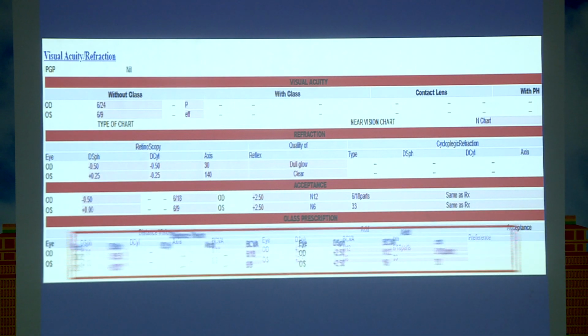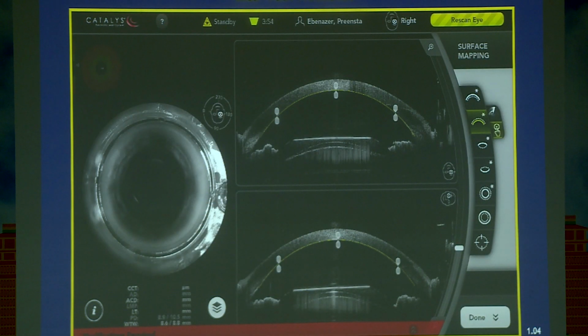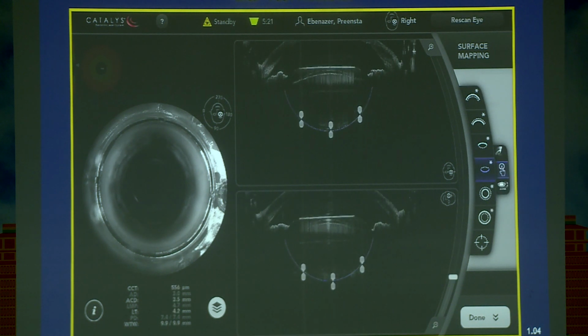And you can see the result that you achieved in this case compared to the phakic intraocular lens. Obviously, the intraocular lens takes care of the refractive error even better. But this is not the way to do it primarily because of the retinal complications that can be associated with it. It's also possible to use a laser platform even in the presence of a phakic intraocular lens, especially because there's a significant anterior subcapsular fibrosis.